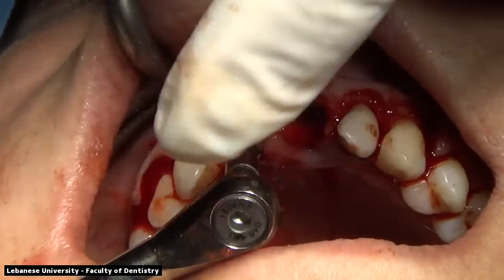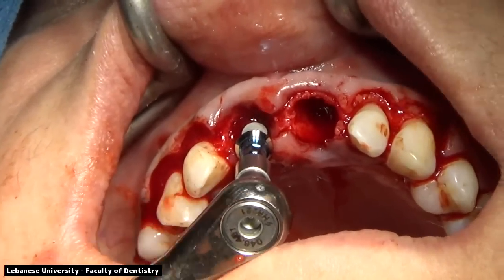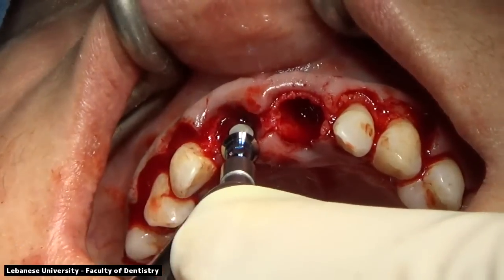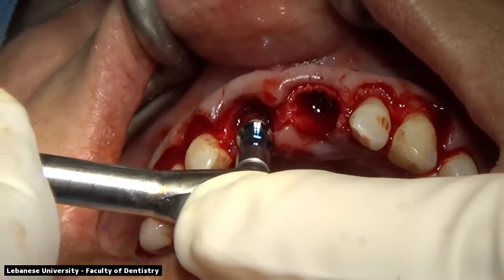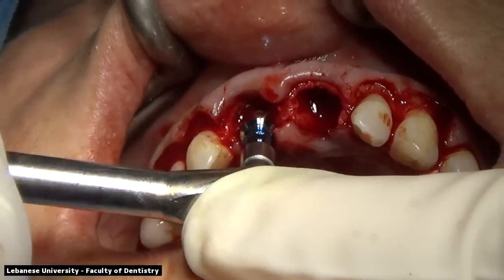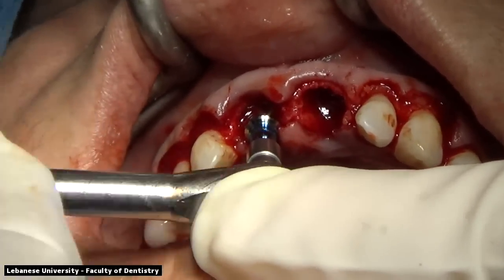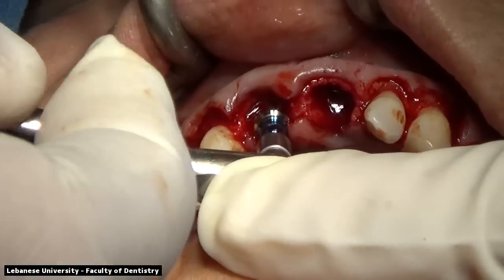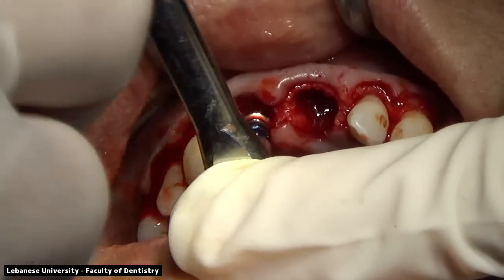We are using the wrench right now to insert the implant, and as we said, the level of the implant will be placed to the buccal plate of bone. So our reference is the buccal plate of bone. We're using the torque wrench to insert the implant by hand. We can appreciate that the implant is being placed to the palatal aspect, and that we do have primary stability of this implant as well.